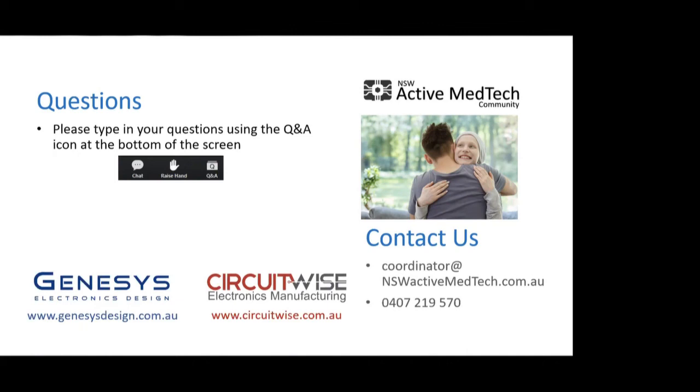And second question: what is your optical digital resolution? Okay, now that depends on what you're measuring, and I'm just going to look up the number, which I have here somewhere, because I always get confused as to what the number is. He says, looking for the right piece of paper. So I think it is somewhere around about a 5 micron transverse resolution of the cornea, and about 9 micron deep.